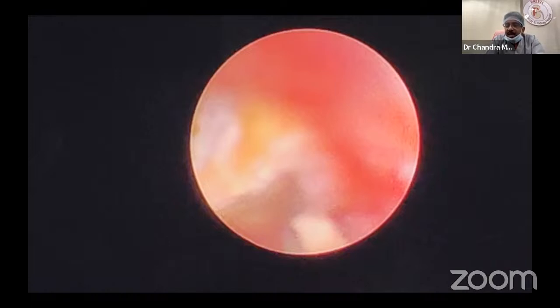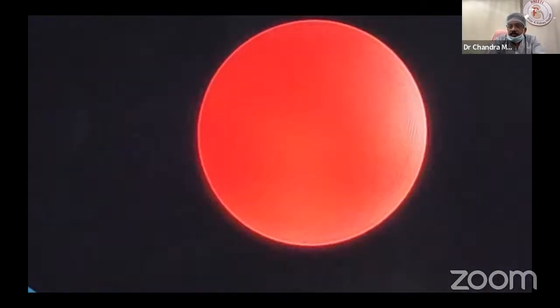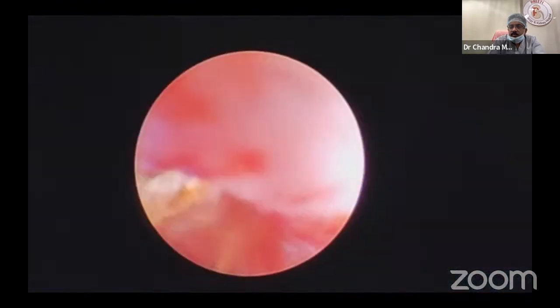So I tried my level best with pneumatic only. Only when you want to smooth a small irregular surface where the pneumatic is slipping can the laser fiber be used. That also I have shown here. Short pulses, at low frequency, so that your precision will be good.